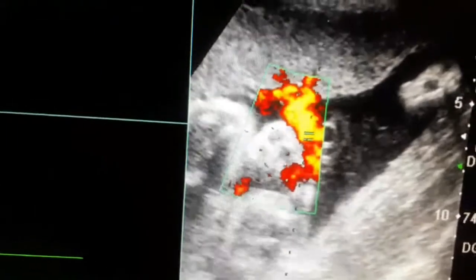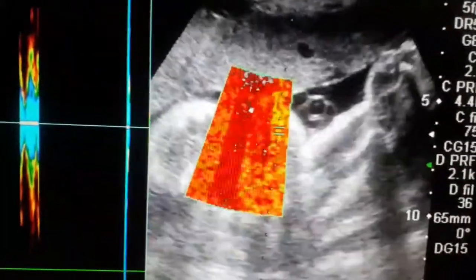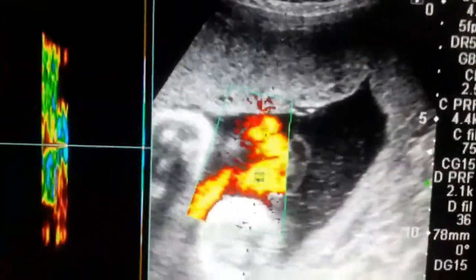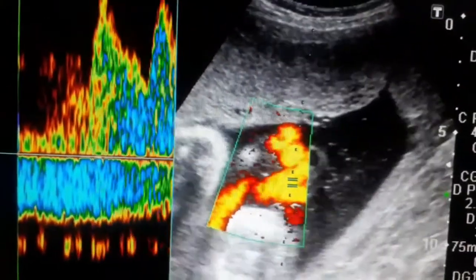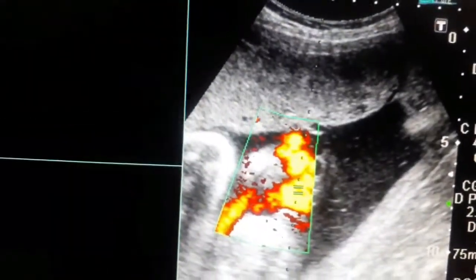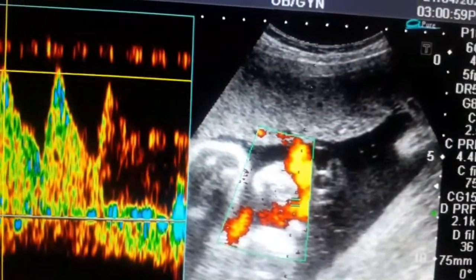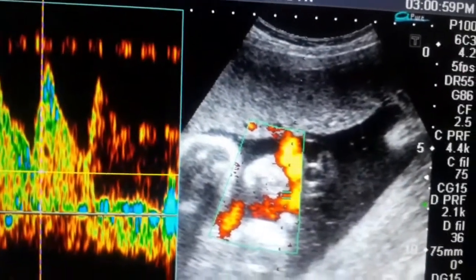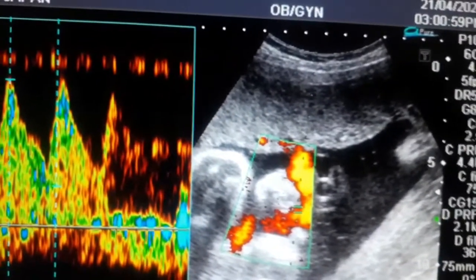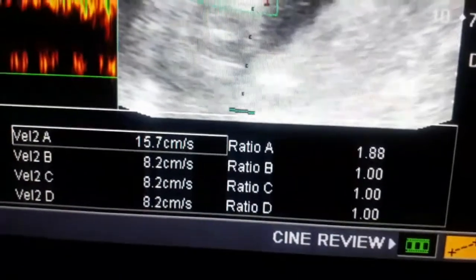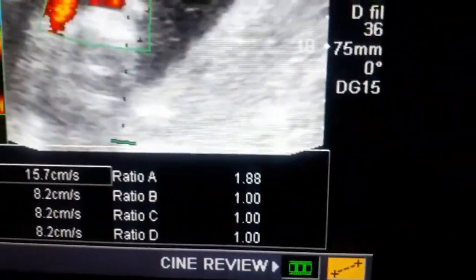Now I would like to put Doppler into the umbilical artery to calculate the S/D ratio. As mentioned previously, the S/D ratio — systolic to diastolic ratio — decreases as pregnancy advances. At 20 weeks it is about 4, and at 38 to 40 weeks it becomes less than 2. In this case we will calculate it — the S/D ratio is about 1.8.